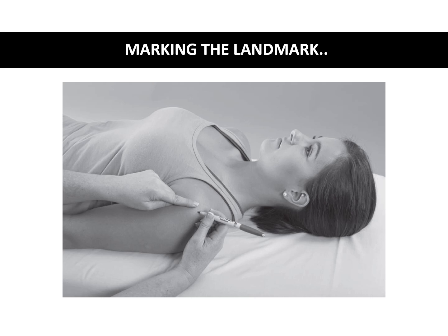So it is important that you expose the area and you palpate the landmark, the bony landmark, and also mark it with a marker or a pen after taking consent from the patient. You need to take the patient's consent or permission before doing any of the above procedures. So once you have marked the landmark with a pen or a marker, you can be very sure that this is the axis and I can place my goniometer axis right at that mark point. So all these factors are very important so that your readings are not wrong and are very accurate and reliable.